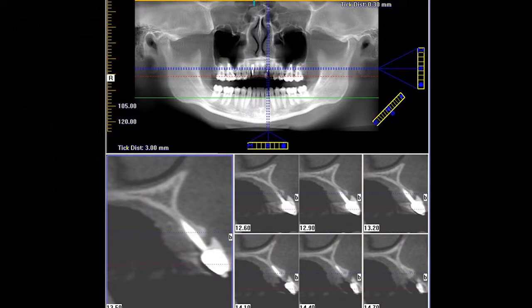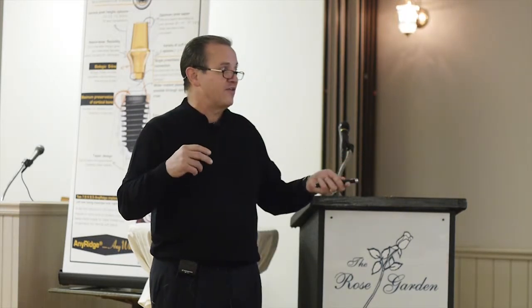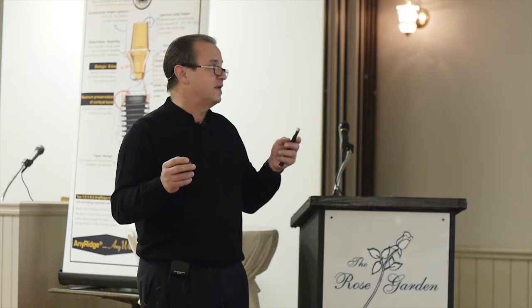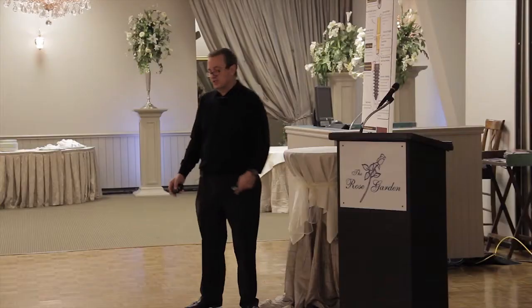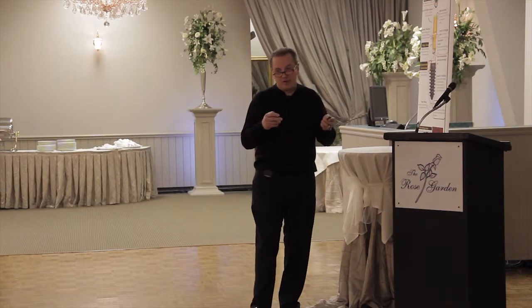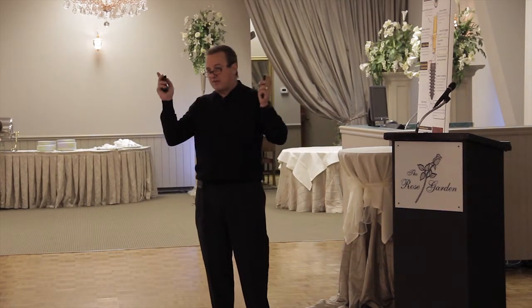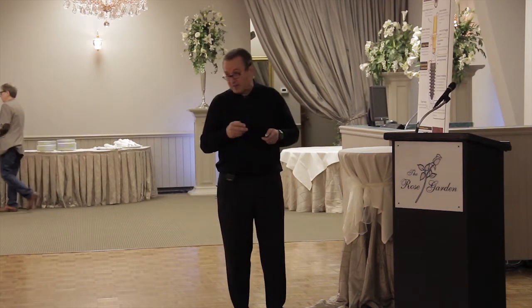Here's the left side, which is a little bit more stable. But it's kind of one of those things, you know, I talked to the mom, I said, we can do all this bone augmentation and build the ridge up and this and that. And I said, on the other hand, we can do some conservative preps, which I don't like to do, but, you know, she was so burnt out and so upset and frustrated that we did the more aggressive thing, which used to be what we call conventional dentistry, and just restored it with 2, 3-unit bridges. Now that I've had more experience with the sonic weld system, which we'll talk about in a little while, I might have gone back and grafted those and waited, but I can tell you they were waving the red flag. She really wanted to get into something soon, and so we opted for what we used to all consider to be standard of care.